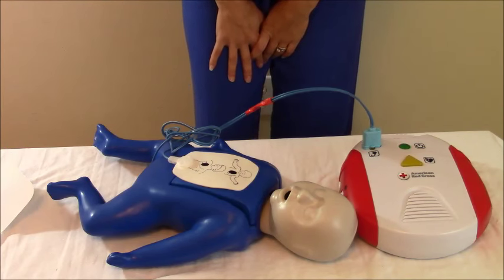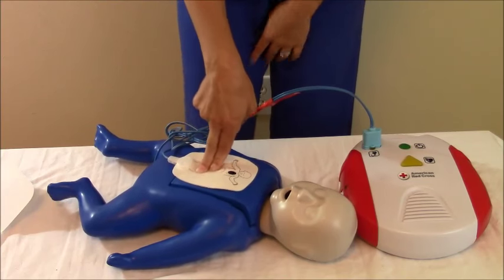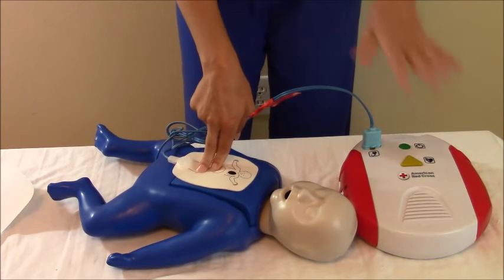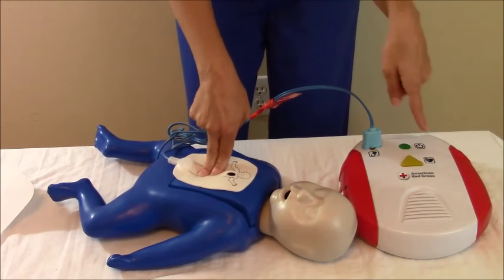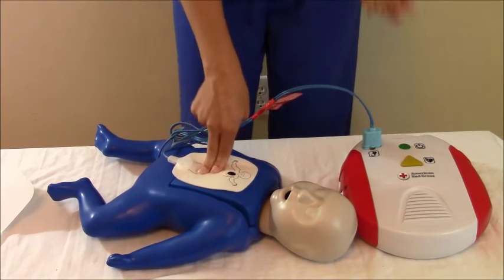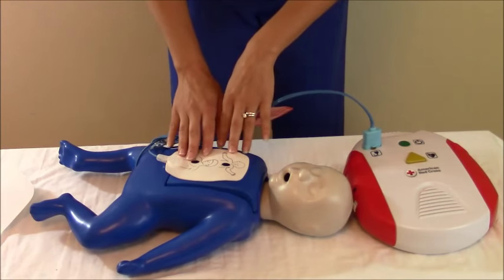Begin five cycles of CPR and then start your CPR back. After five cycles, this machine will reanalyze to see if we need another shock. That beeping you're hearing is just telling you the rate you need to go, because you need to go hard and fast. That is how you use an AED on an infant.